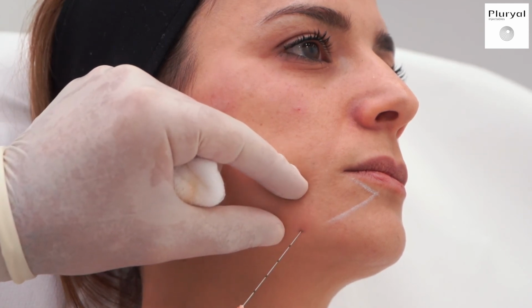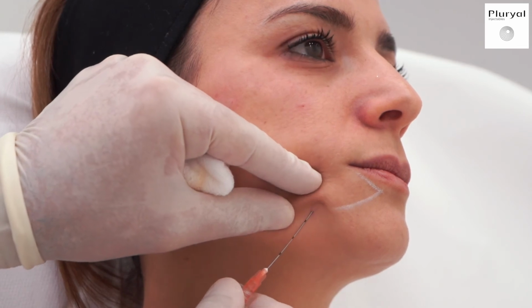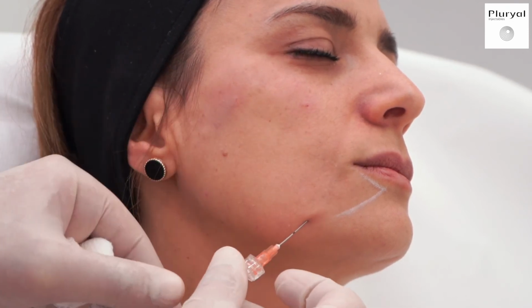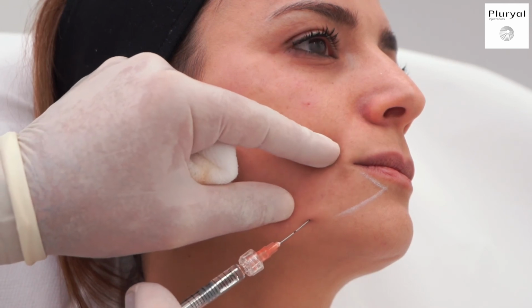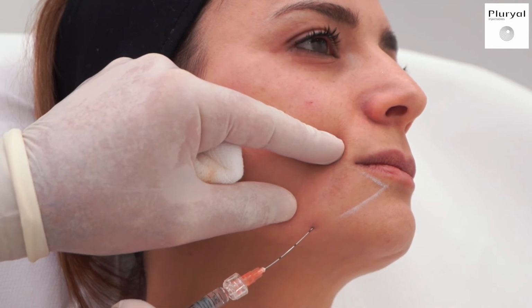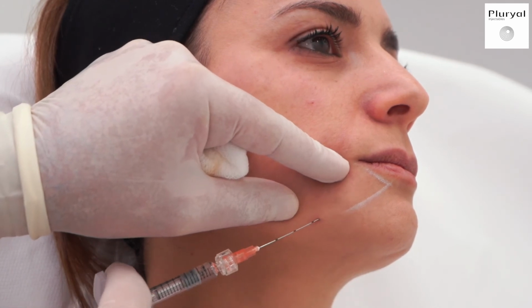So first I go in the marionette, I go all the way up to the lip, and then I do fanning.